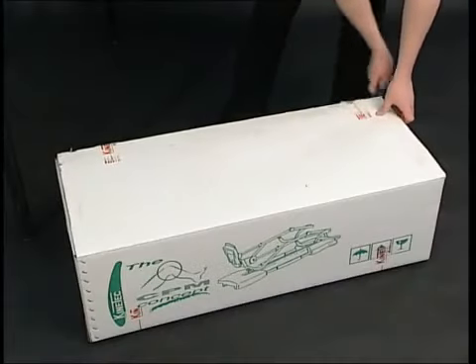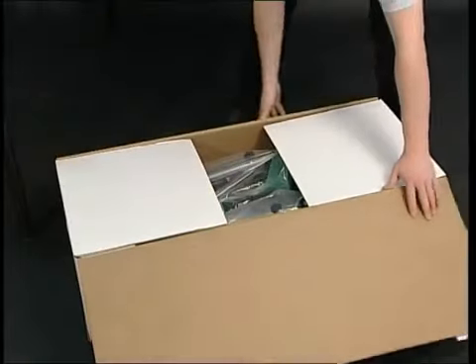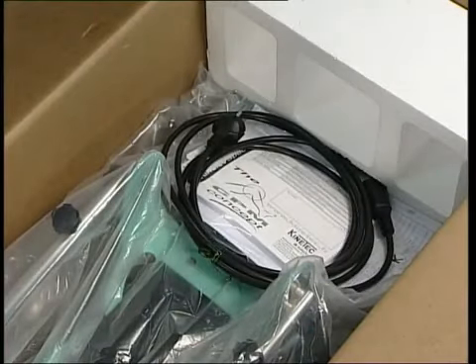Your Kinetec Spectra is delivered in reusable packaging. You are advised to keep it. Open the box and take out the package, including the mains cable and the documents.